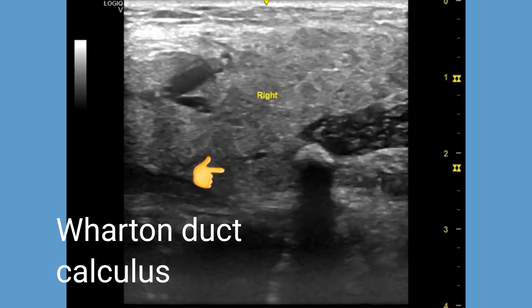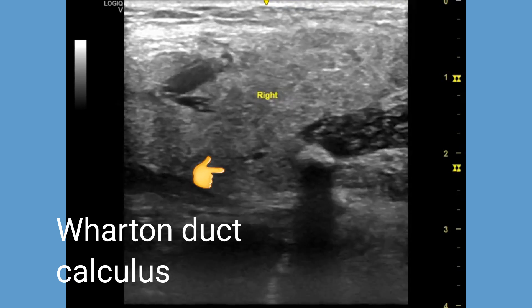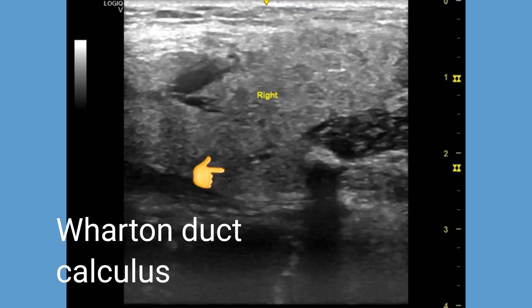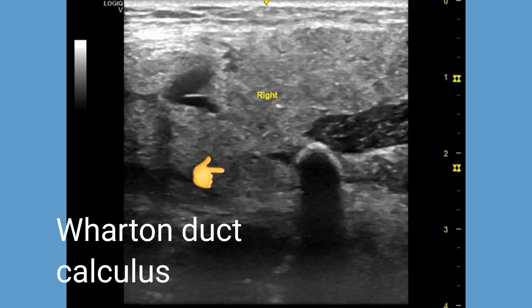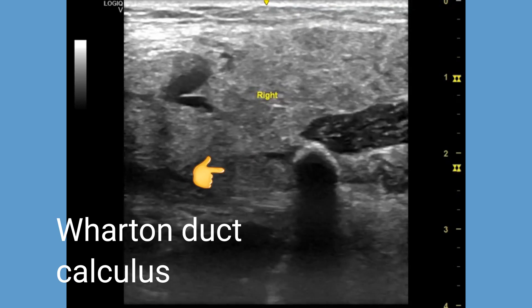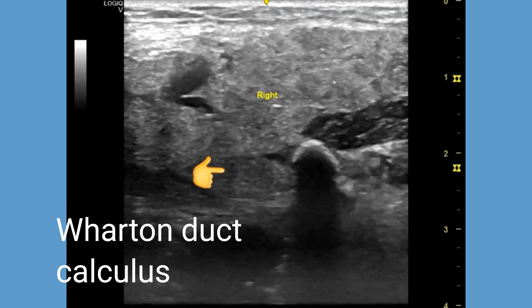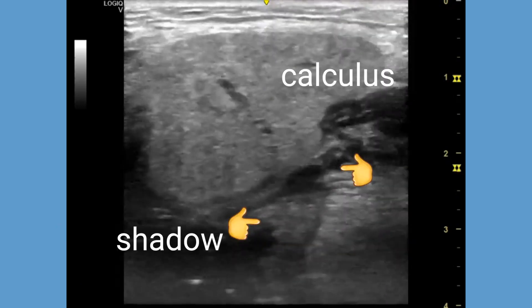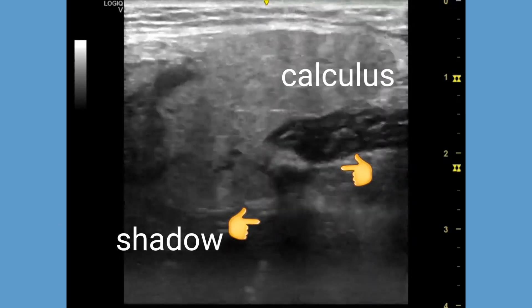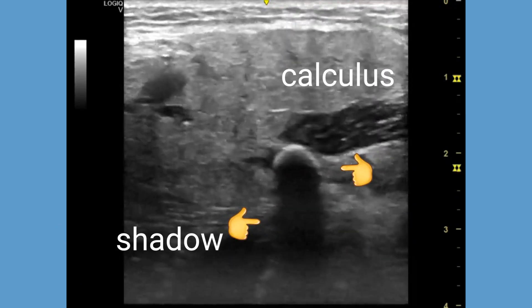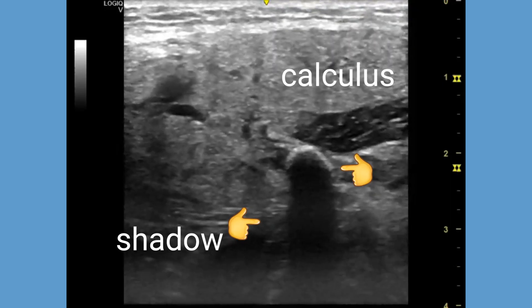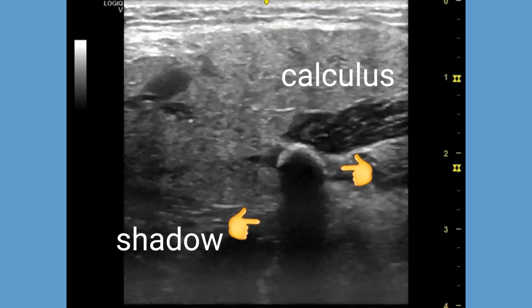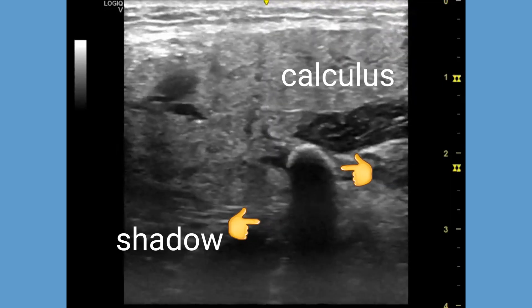In this case, the ultrasound shows a sub-mandibular duct calculus, also known as a Wharton's duct calculus, of 8 mm diameter. This is large enough to cause obstruction of the Wharton's duct and produce symptoms.